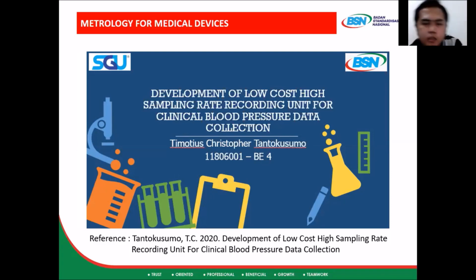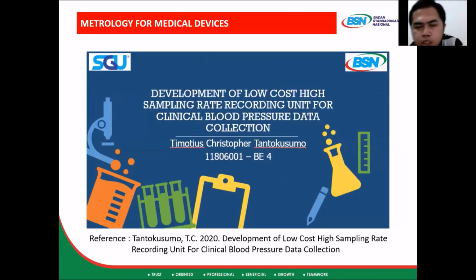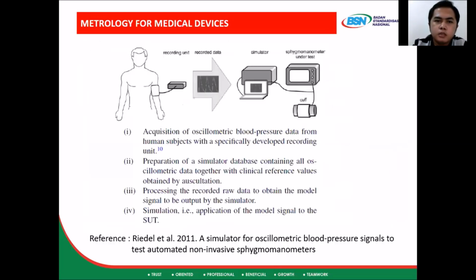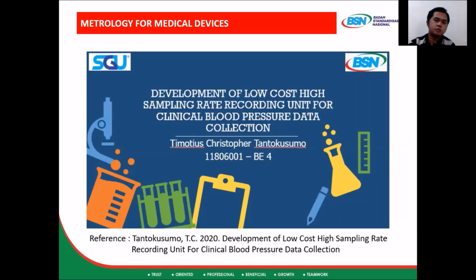He is working on the development of a low-cost, high sampling rate recording unit for clinical blood pressure data collection. So this project is basically to develop the recording unit before establishing the simulator itself, to collect the database of blood pressure simulator. Yes.